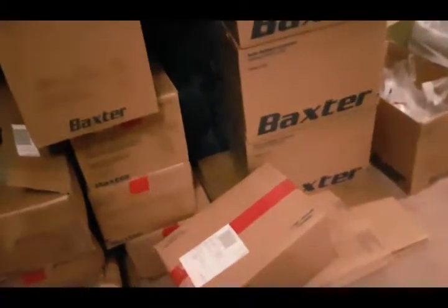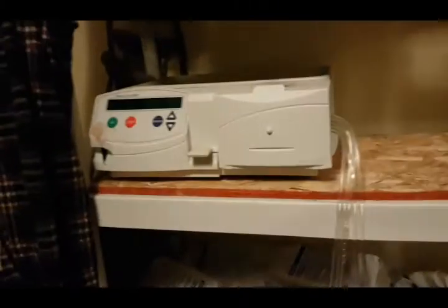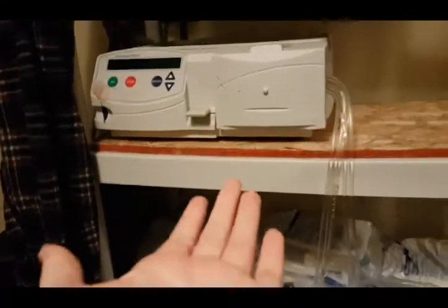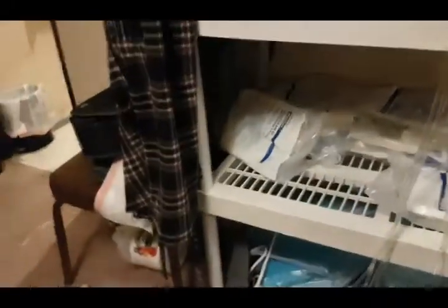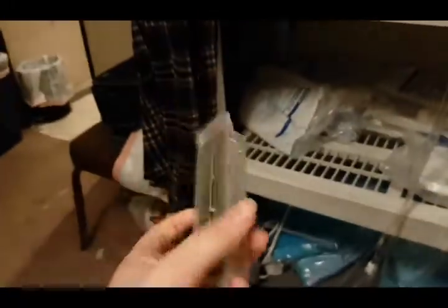He has to do blood pressure, weight, and temperature every day, and check all that every day, to make sure that's all good. Now, what happens if there's a power outage? What happens if your machine doesn't work and you don't have a generator or something like that? Well, there is a way to manually do that.